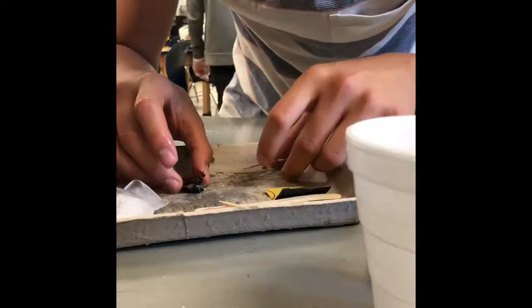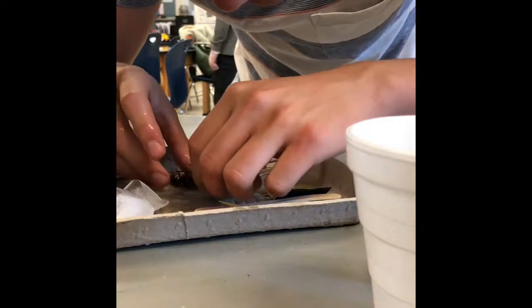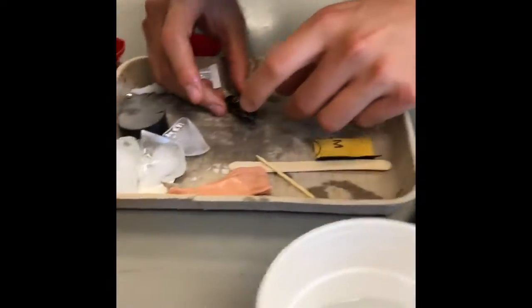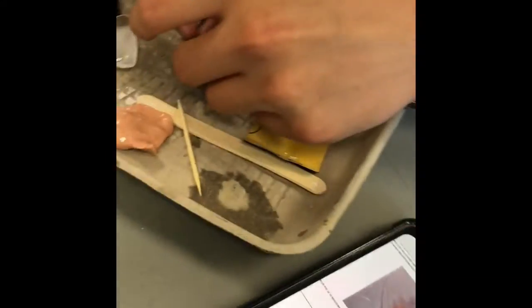Take the roach out of the ice water and place it on its back. Splay the antenna out to cut the left antenna to about 1/8. After this, place the right electrode inside the right antenna and add a tiny bit of superglue.